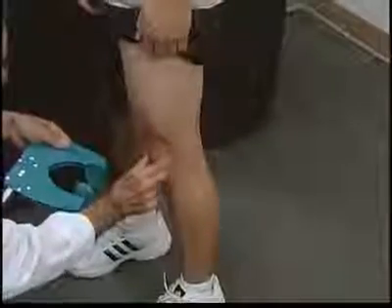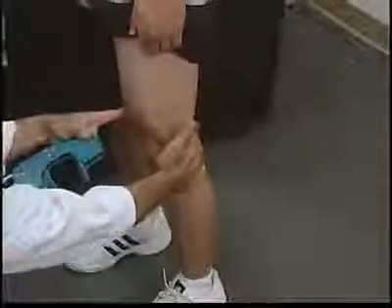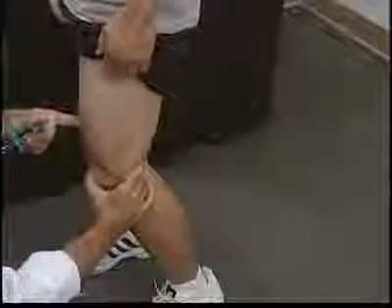Locate the patella. If locating the patella is difficult, have the patient flex their knee to help you find it.